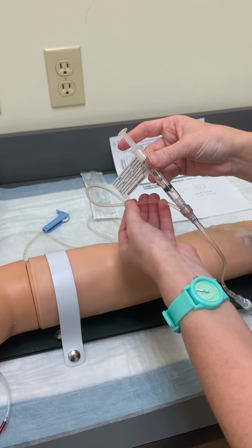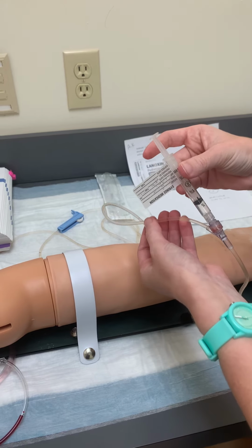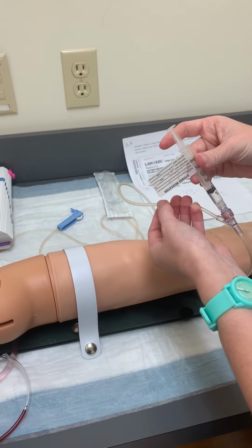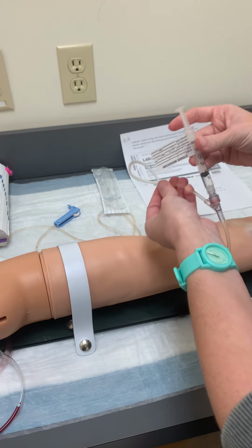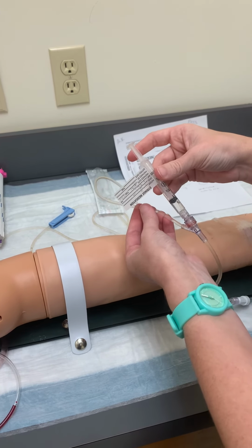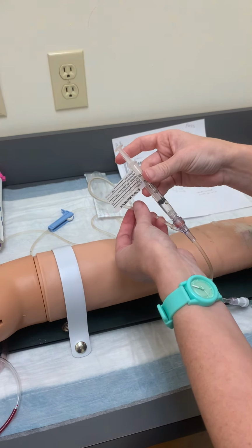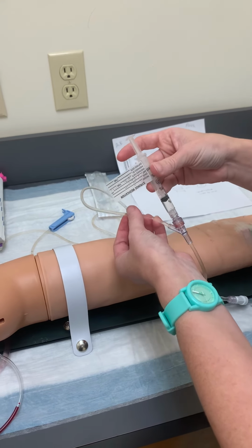And the whole time I'm pushing the medication, I am observing my patient for any adverse reactions, any closing of the throat, any swelling of the eyes, any signs that they may be allergic to the medication, and also the signs and symptoms of digoxin toxicity as well.